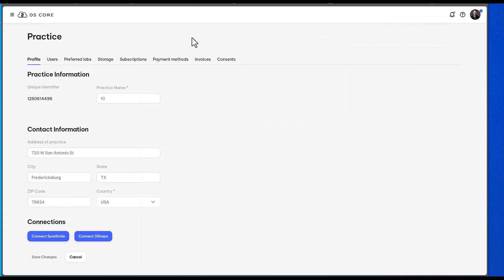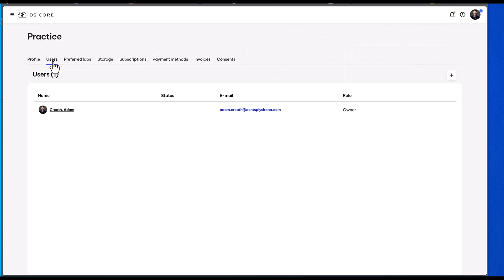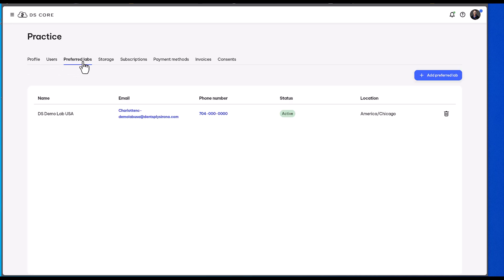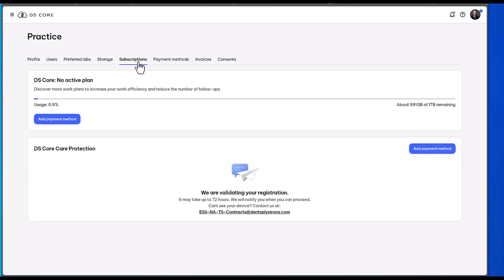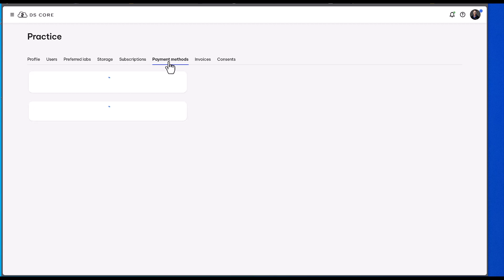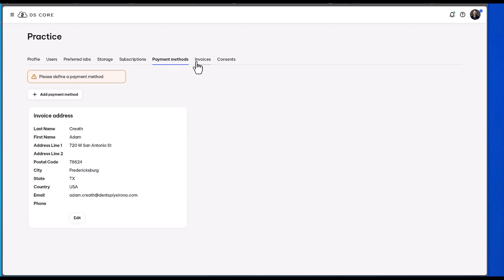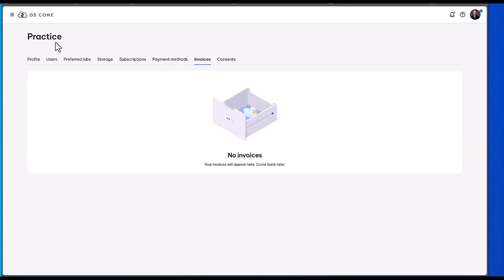So you'll see here, this is my demo account. I've entered the practice screen. This is where we have our profile, the multiple different users assigned within our office, any preferred labs that we like to work with. It also shows our storage of how many files we have saved, the subscriptions and the active service plans that we're on, payment methods that we've assigned, invoices, consents, etc.